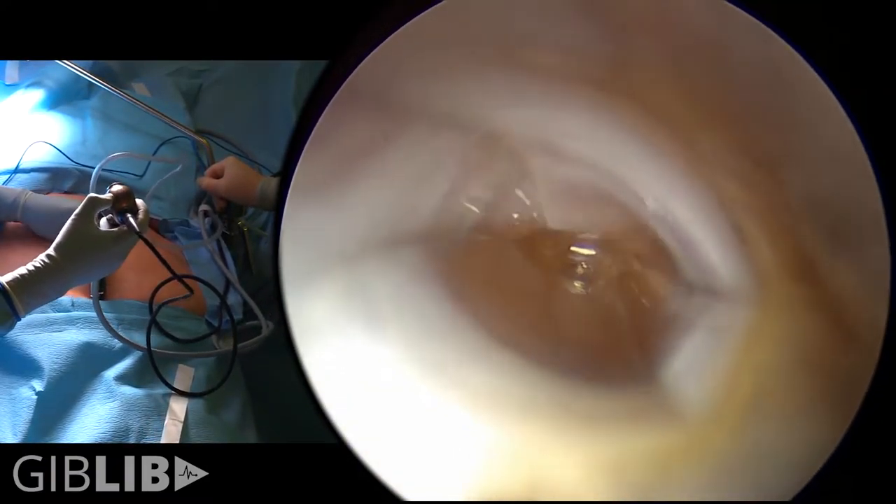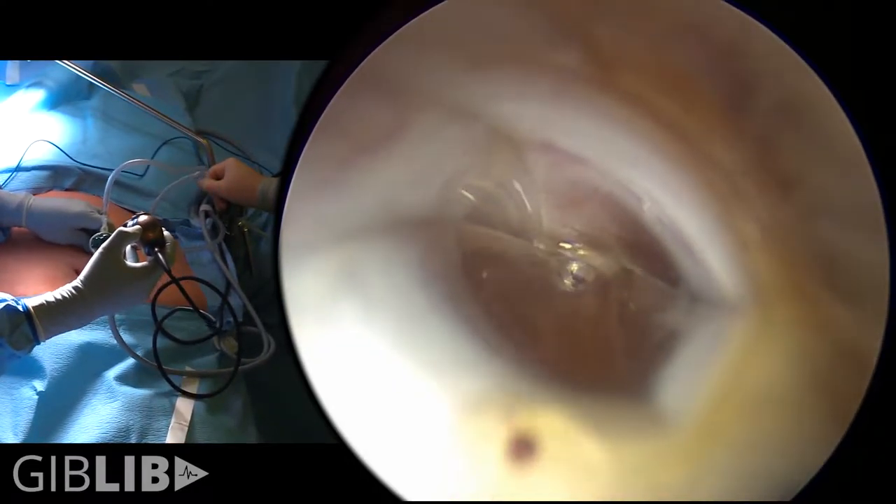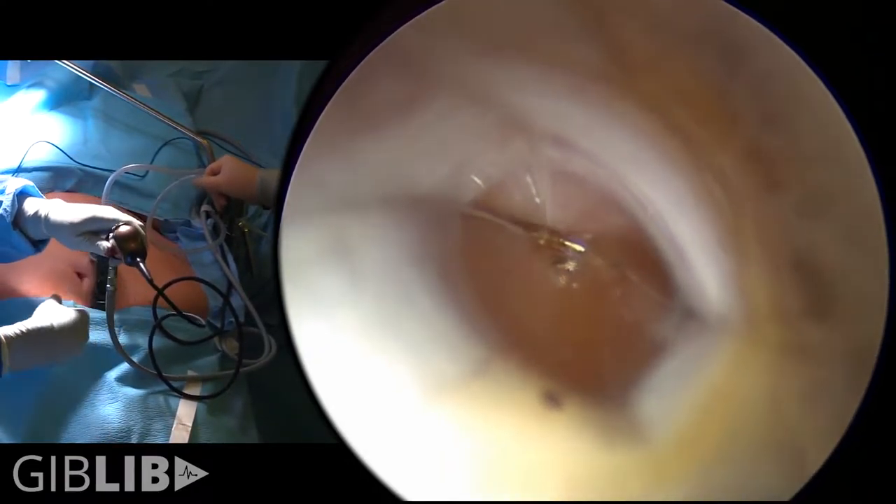As you can see from this view, we've just crossed the peritoneum and this little hole allows us to do insufflation. Can we go to high flow please, Lindsay?